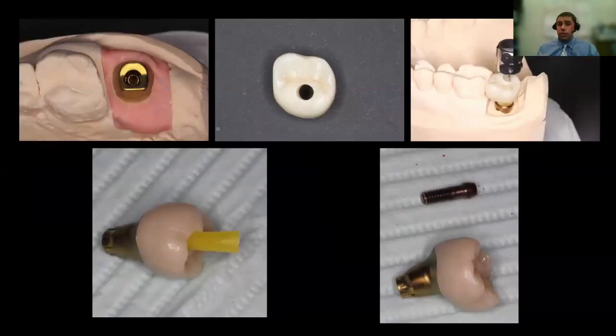So those are manufactured as two pieces. You have the crown and the abutment, which can be done at the same time. Then they can be delivered as two pieces by the lab, and you can cement those chairside for your patient before insertion.